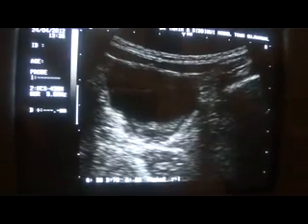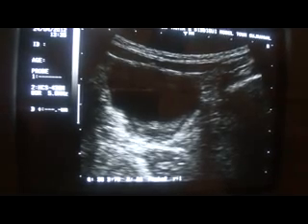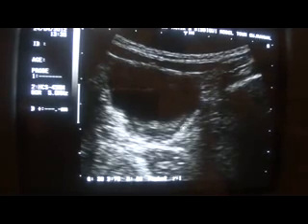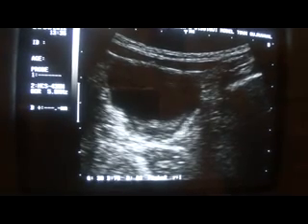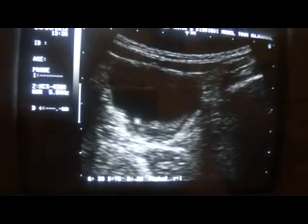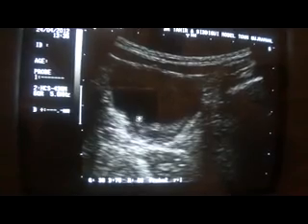You see, here I am in the longitudinal section, manipulating the probe just like this, and let me share what I am seeing. There you see, this is the calculus. It gives posterior shadow. This is the posterior shadowing.